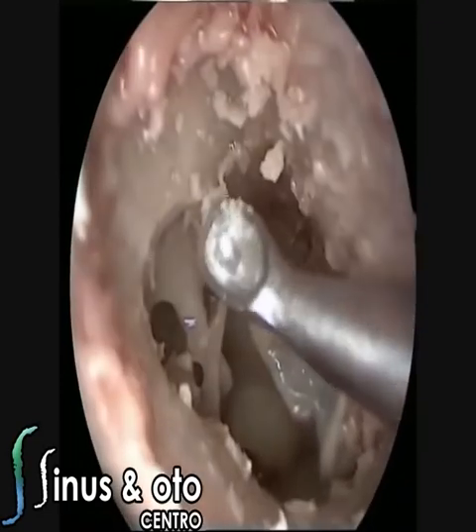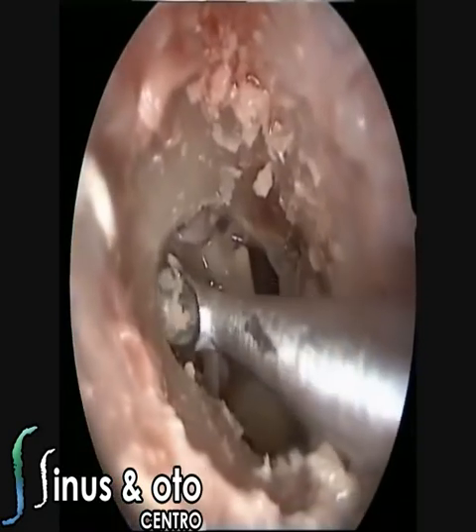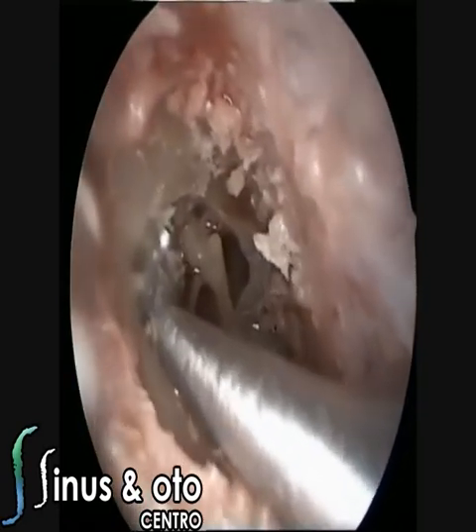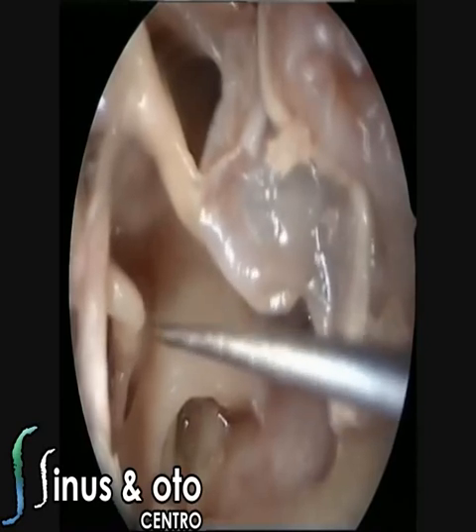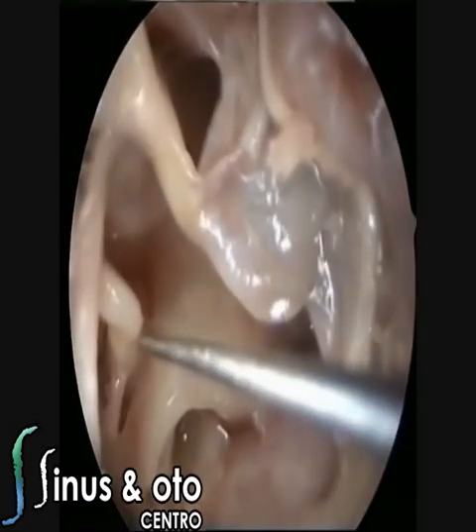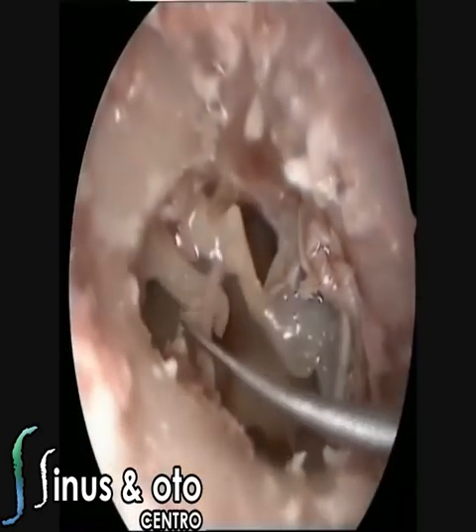So once you remove this, you can see very well the articulation between the malleus and the incus, the short process of the incus, the long process of the incus that articulates with the stapes, and of course the stapes at the oval window. So you have here the articulation between the stapes and the incus, the long process of the incus, and for this dissection we are going to remove the incus just to show the anatomy that you can see here.